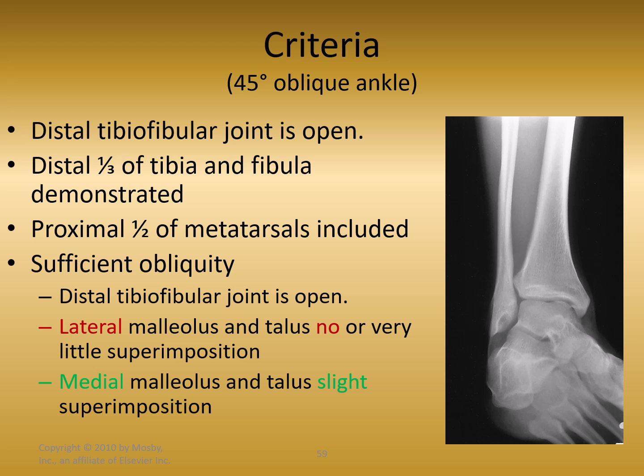45-degree oblique ankle. All right, we can see the differences already. One thing you can look at is where those metatarsals are going. See how far they're going medially. They're rotating medially, inward toward the tibia, I'm sorry, medially toward the tibia.